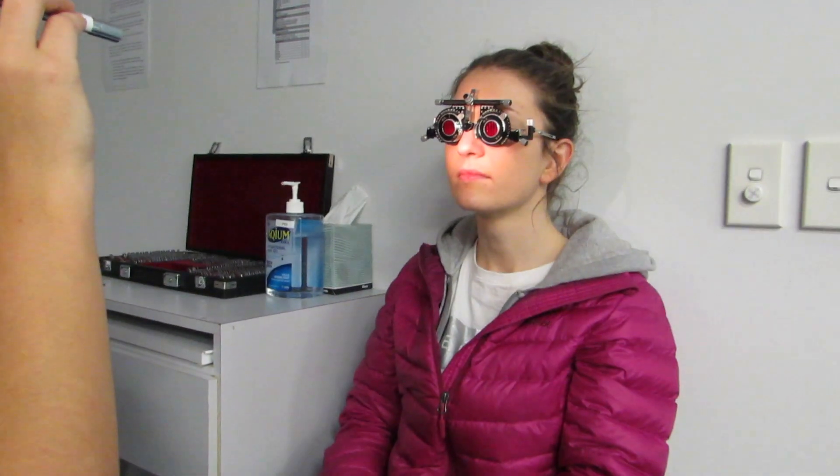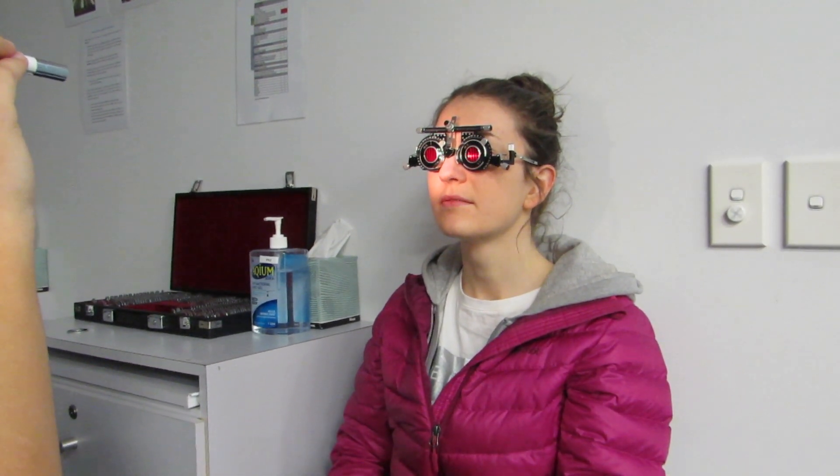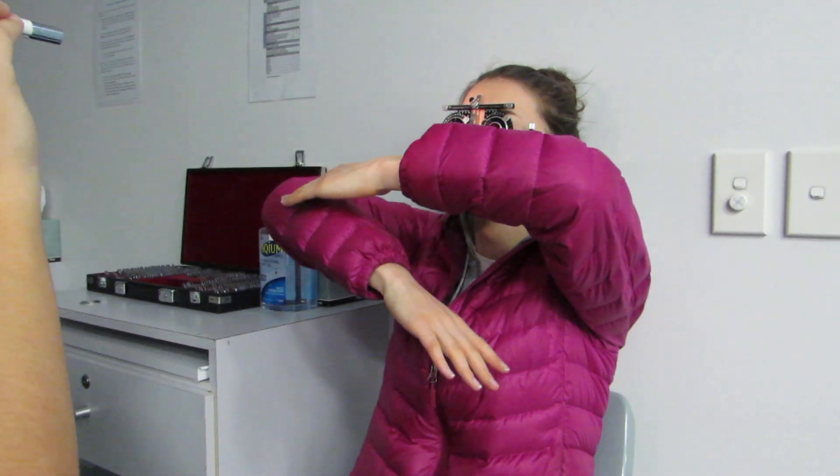The clinician asks: 'So Adele, what can you see now?' The patient responds 'Two lines.' The clinician confirms this and then asks the patient to use their arms to show where the lines are, which the patient demonstrates.